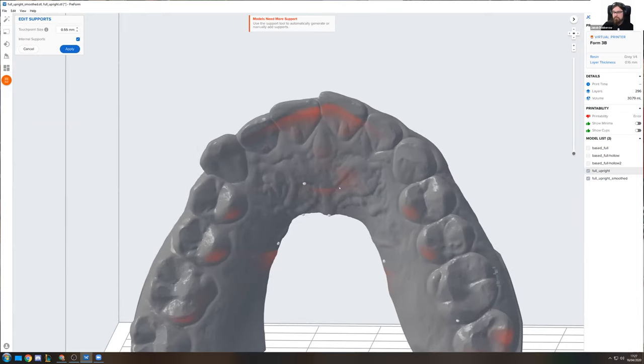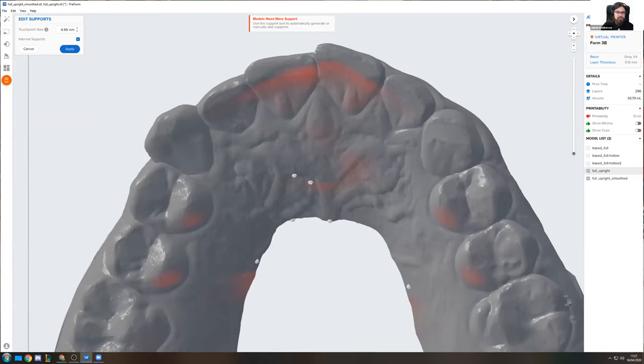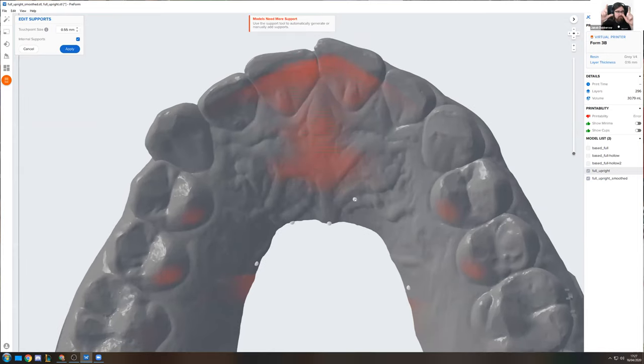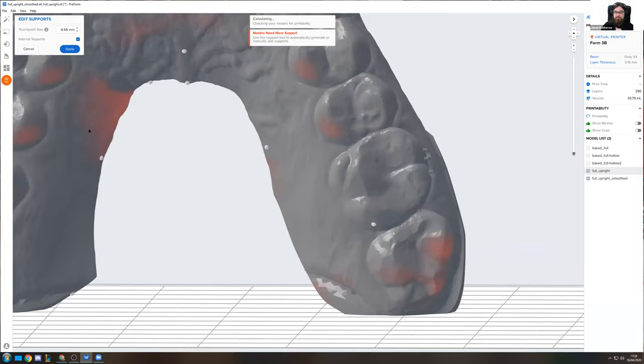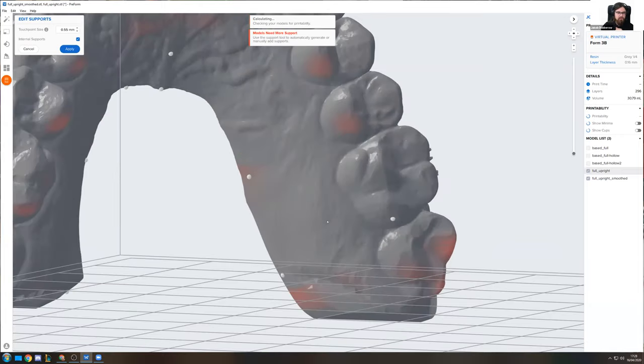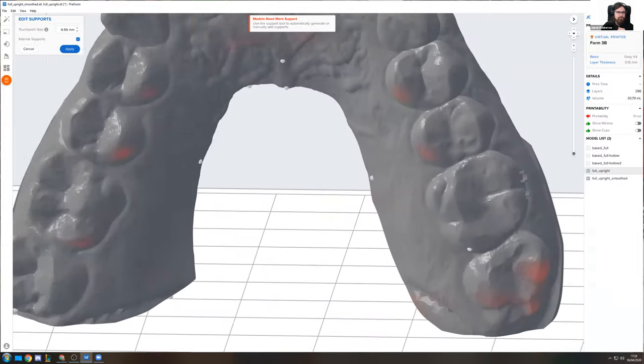So this is also a technique which can help you cut down on the amount of supports quite drastically, because what I see a lot of people do is they see a big red shaded area like this one, and they will put a support in the middle of it. But the support that I'm placing right there can't help me with any of this area that's right here, because that has already printed in an under-supported or not well enough supported way. So instead of putting it right in the middle of this red shaded area, putting it at the start, or before it even becomes red shaded, you can see that this takes off a lot of this red shaded area right here. And then you can do the same thing where you just left click a support and just reposition it to basically start out earlier in this way.